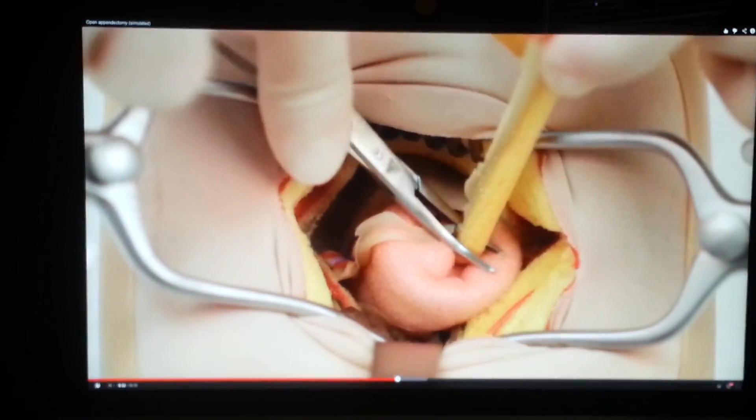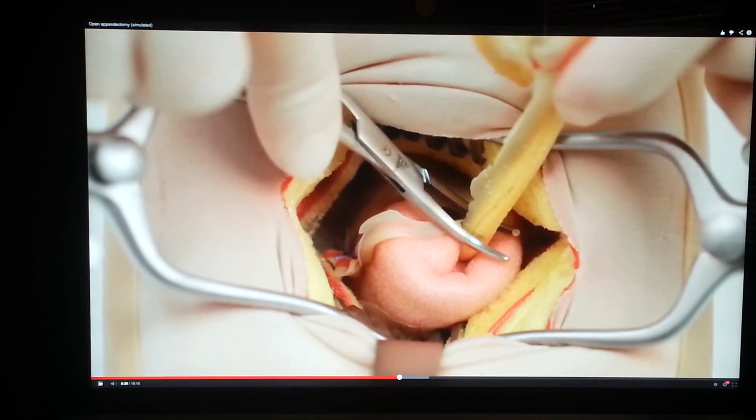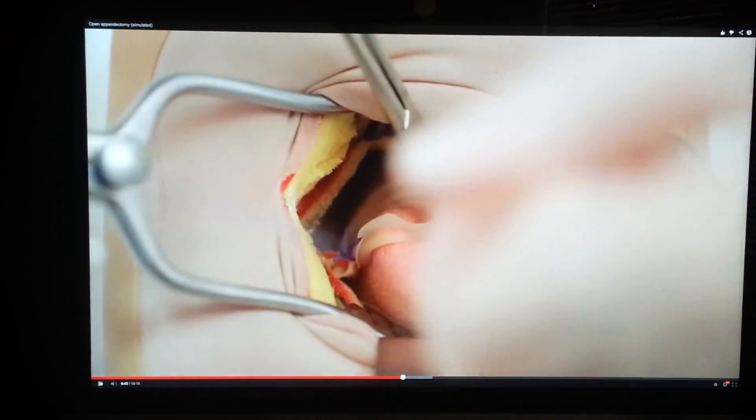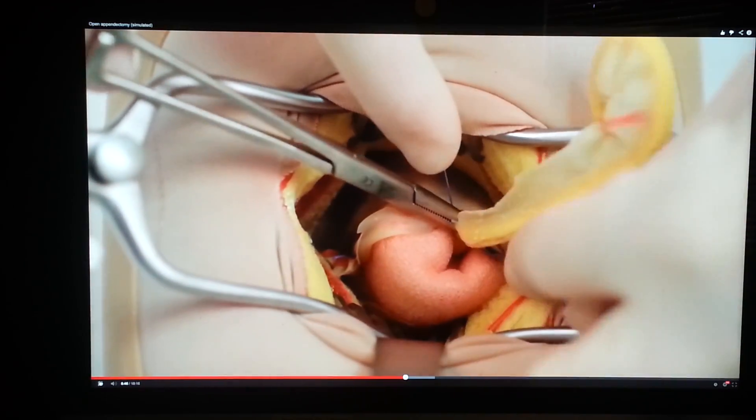Crush the appendix base with a haemostat and replace it distal to the crushed segment. Doubly ligate the crushed segment with 2-0 Vicryl.